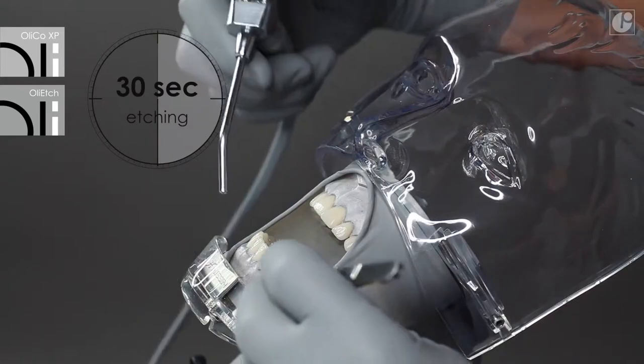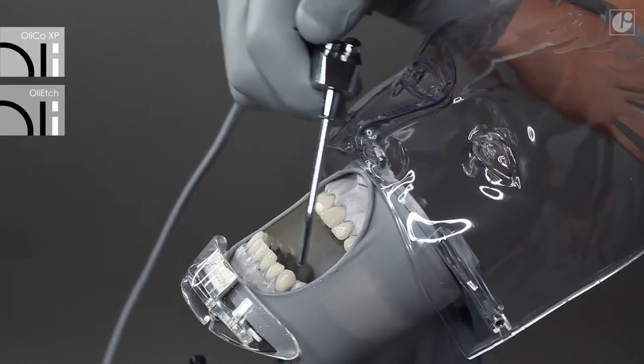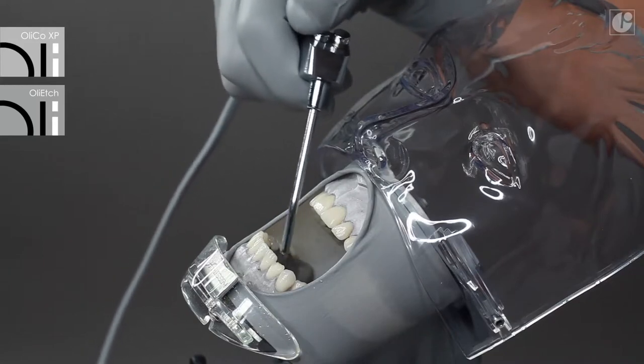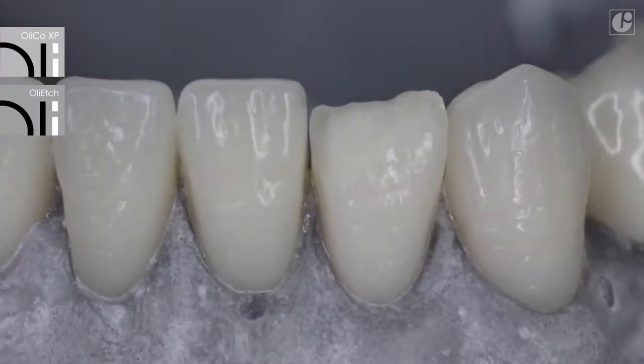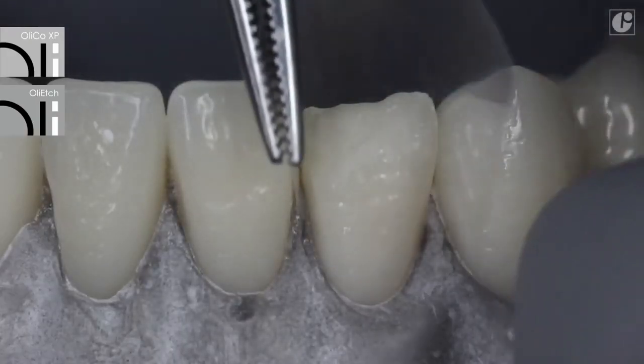After the required time has elapsed, rinse the treated surfaces and gently dry them. Dentine should remain a little moist so that collagen fibers do not collapse. This significantly improves the surface of bond adhesion.